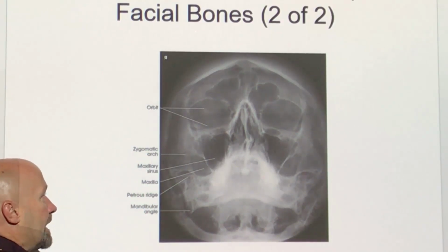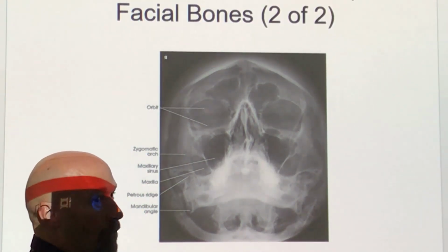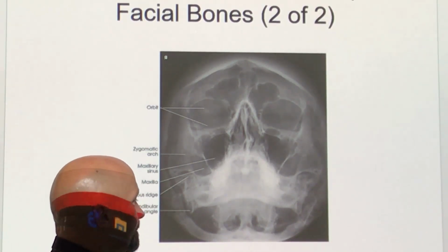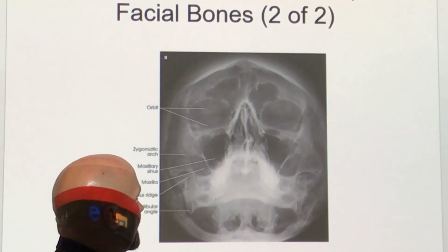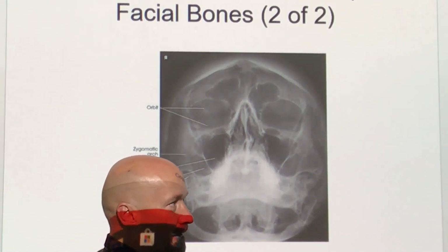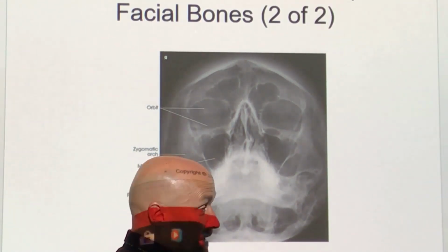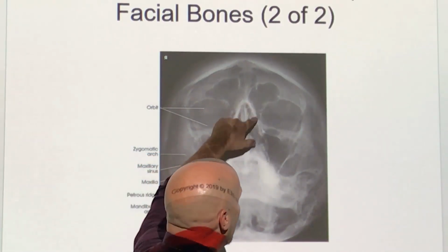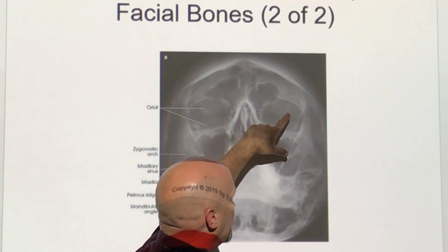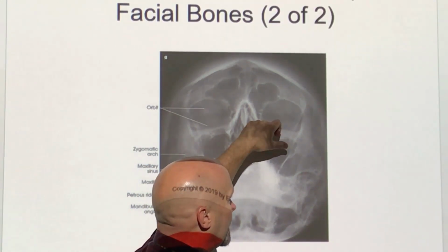One indicator that you can look for to determine whether or not you've got proper extension of the chin is kind of like looking at the Scotty dog on the lumbar vertebra. Only this is an elephant. So you got a big ear right here, and it takes a lot to see this, even more so than the Scotty dog.